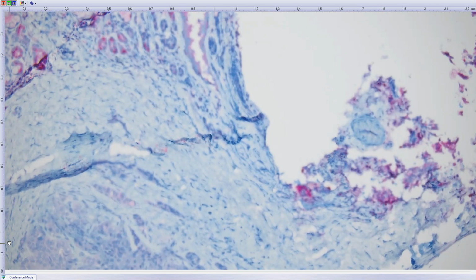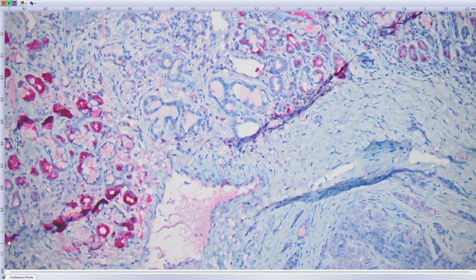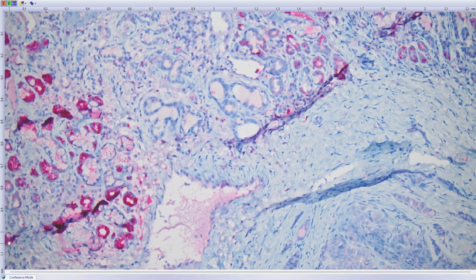So I think this is seromucinous hamartoma giving rise to cribriform carcinoma of minor salivary glands. In the middle, you see atypical glandular formations, cells that are between the adenocarcinoma and seromucinous hamartoma. So that is the first case I ever saw of the origin of the tumor.